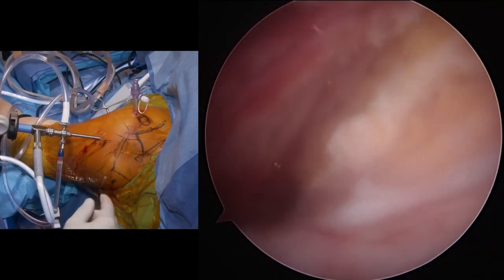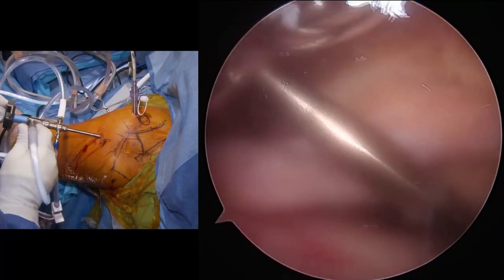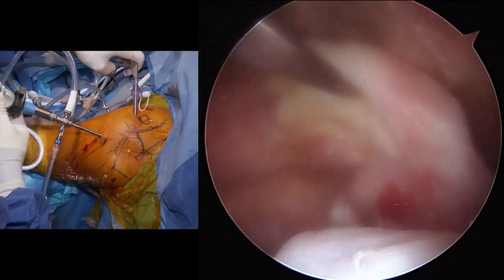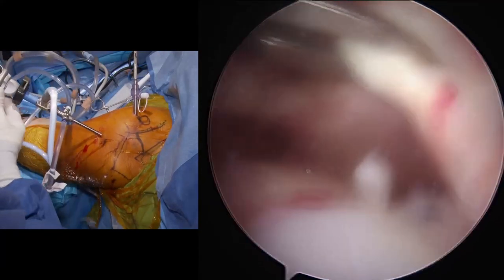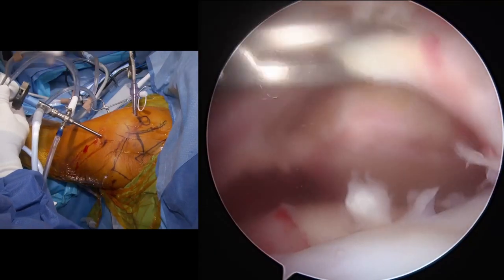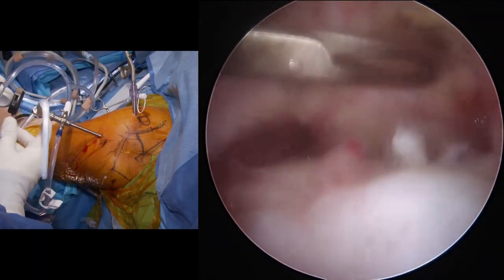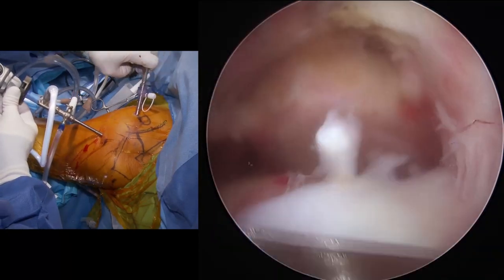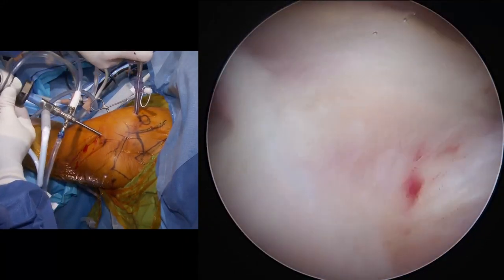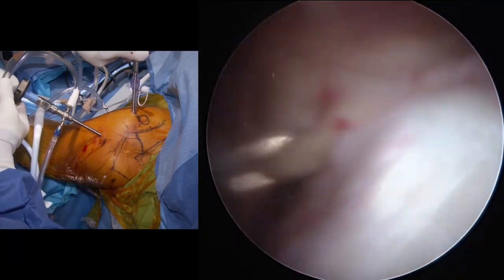Wow, this is just not good. Well, that's where it's supposed to be. So that's the reverse L-shaped tear. It's off the edge, but it's mostly, if you look here, mostly tendon to tendon. It's not tendon to bone. And it just comes off this bony edge right here, and then it's split through the tendon, which is not ideal in terms of a healing process, but that's what we have to try to repair. So it goes down like that, and that's what we have to try to accomplish for this guy.